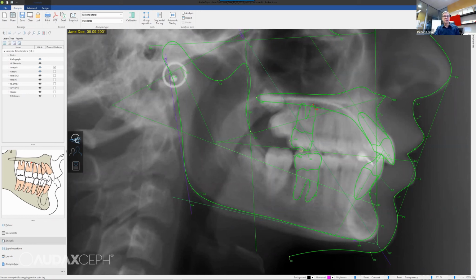Also, if you have a company and you are working through the cloud, so your patient management software is cloud software, that PMS manufacturer will be able to connect through what we call an API to the portal, and you just click, I want that image scanned, and everything will be done automatically and sent to your patient management software, which is a really cool functionality. You will of course be able to move some points around if you do not agree with what we do automatically.